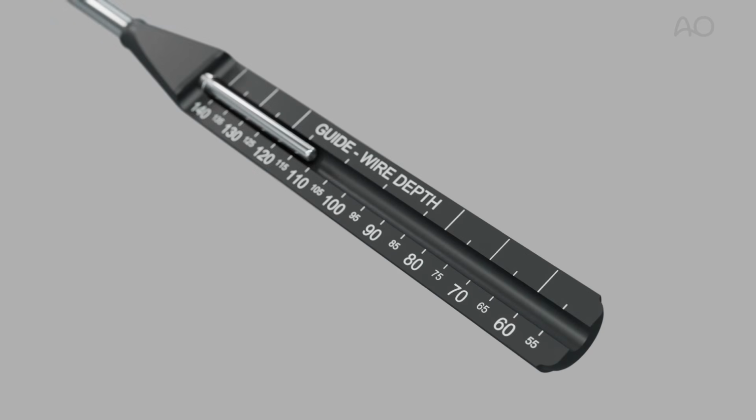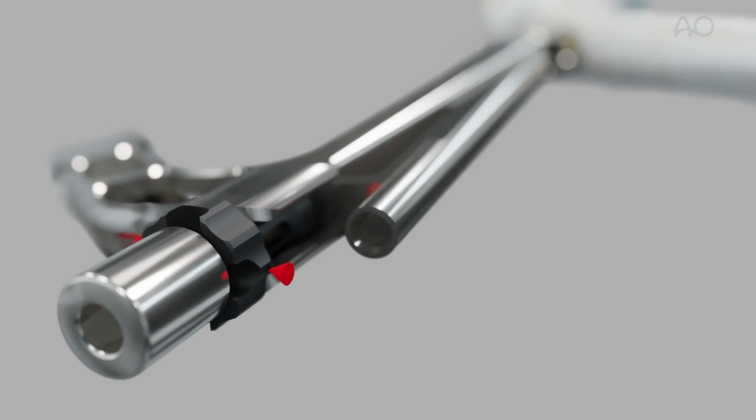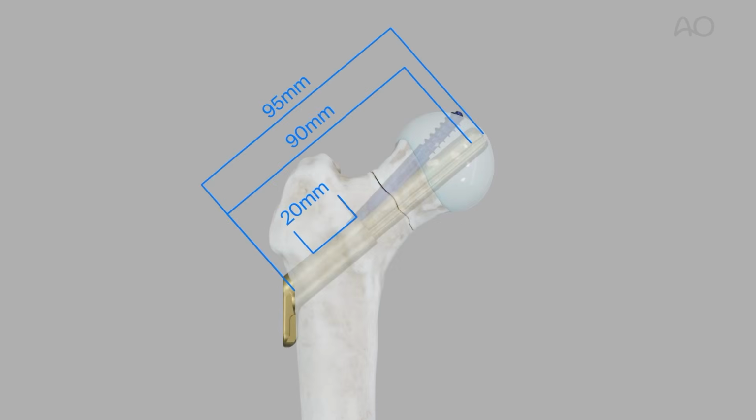In a case of a 90 mm implant where the amount of collapse needs to be reduced, a 5 mm longer implant is used. Prior to insertion, the black screw on the insert is loosened by 5 counterclockwise half turns, equaling a 5 mm reduction of the sliding distance, which decreases the collapse distance from 20 to 15 mm.